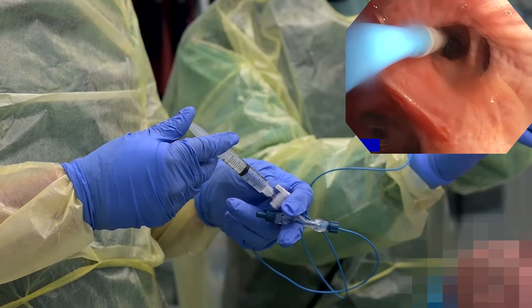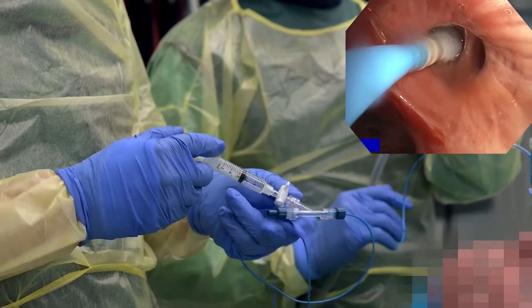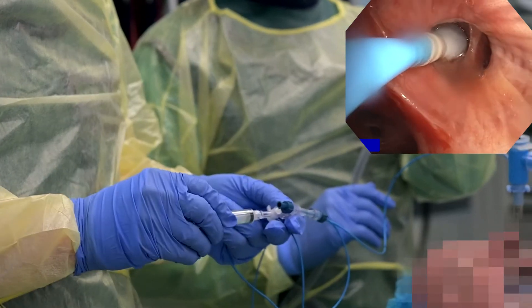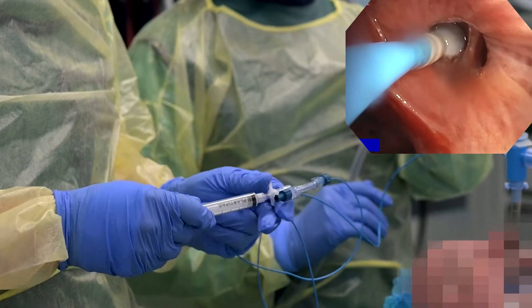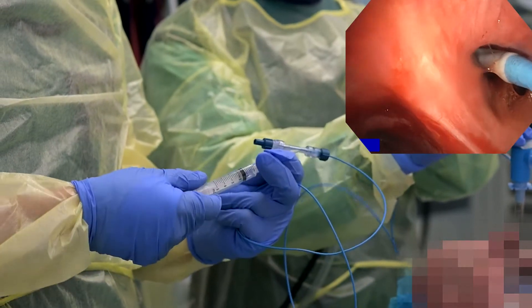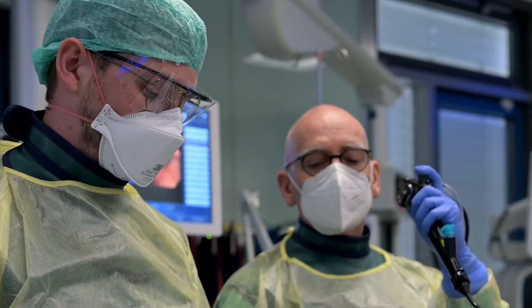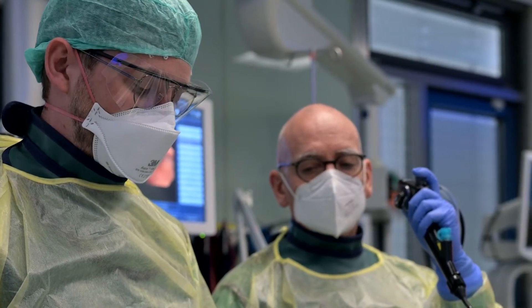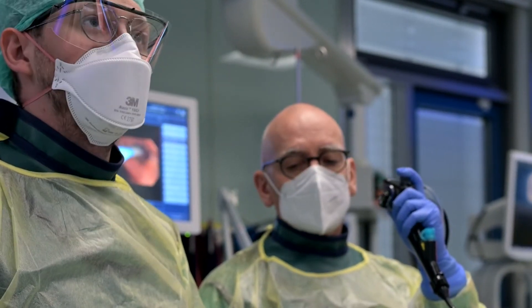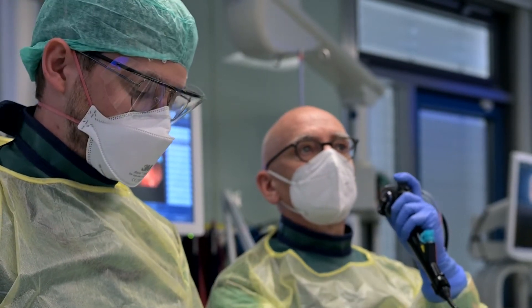After placement of the endobronchial blocker in the segmental or further distant bronchus feeding the biopsy area, test inflation is performed. The balloon should have a contact surface suitable for isolating the area from the rest of the airway in case of bleeding. Water or air can be used to block the balloon as per manufacturer's advice and bronchoscopist's preference. After test inflation, the exact volume needed to inflate the balloon intra-bronchially for appropriate contact to the airway wall is extracted with a syringe and kept inside it.